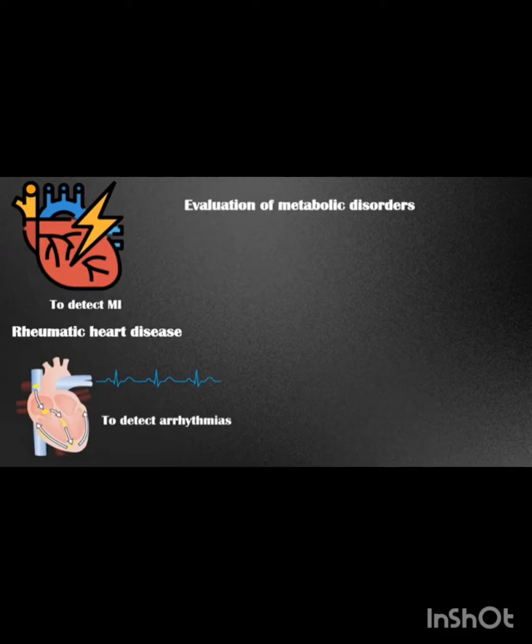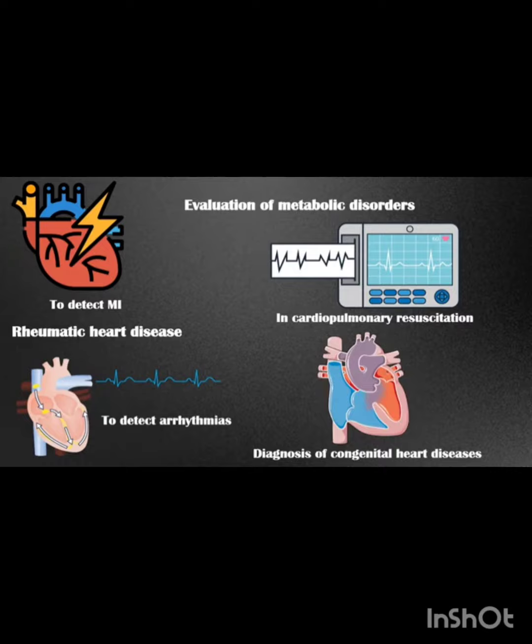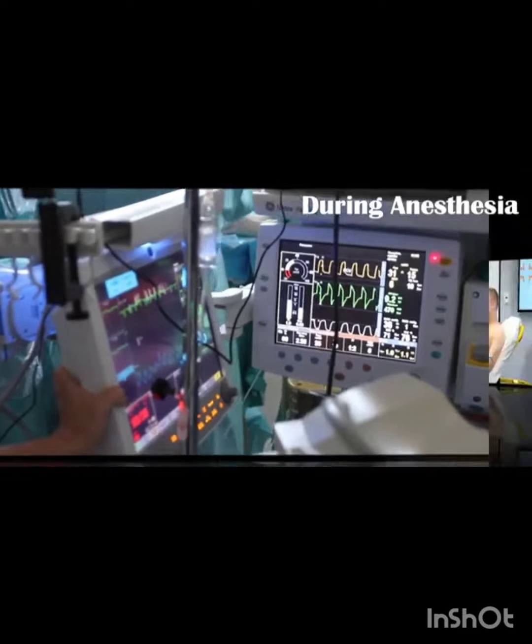In the evaluation of metabolic disorders. In cardiopulmonary resuscitation. To facilitate the diagnosis of congenital heart diseases. And during anesthetic procedures for the continuous monitoring of cardiac function.